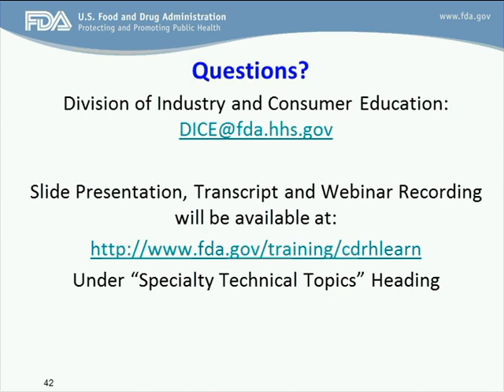Second part of the question is for positive device controls, does the new guidance address the soil accumulation over time and or provide suggestions for methods on device-specific collection and simulation? Hi, this is Steve Elliott. With soil accumulation, this is something that is expected to be addressed through validation testing. However, it is something that might vary from device to device, so it could be a device-specific concern related to issues cleaning and reprocessing a specific device line or device type within that. So probably that is a question that would need to be addressed by the device-specific office.